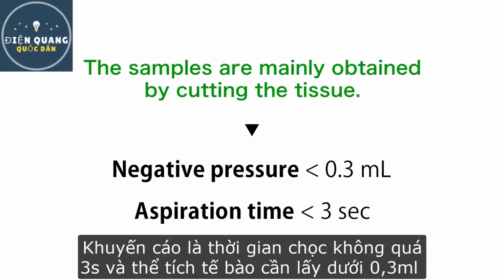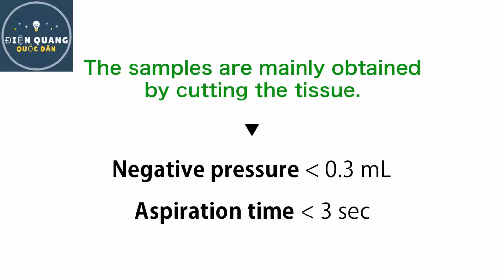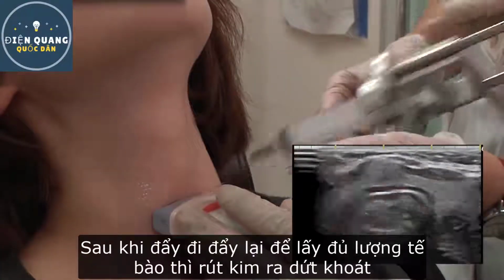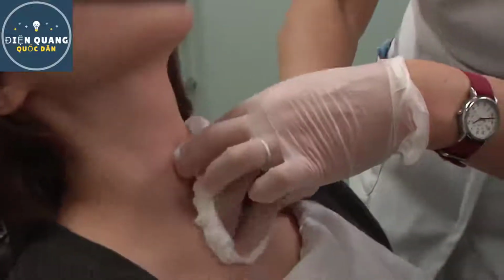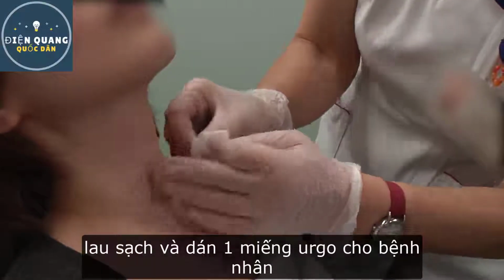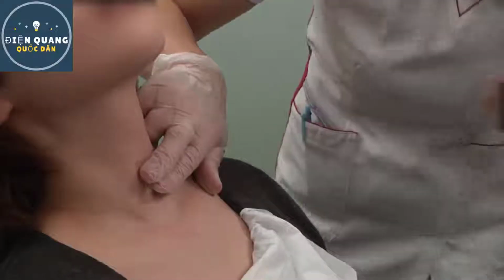The negative pressure is not very important. We recommend negative pressure below 0.3 milliliters and aspiration time up to 3 seconds. After the piston movement, we release the pressure and extract the needle. Then we apply a bandage on the explored area and press it.